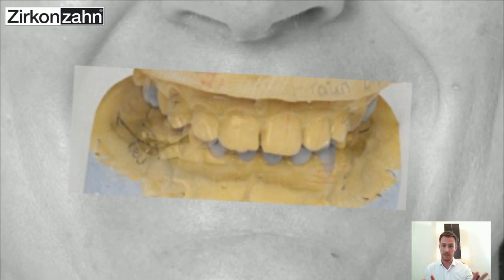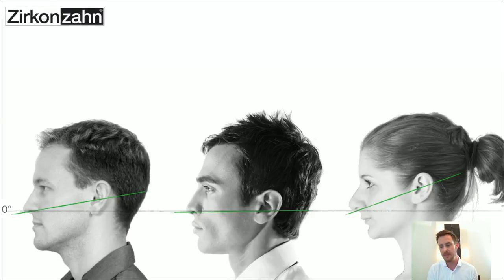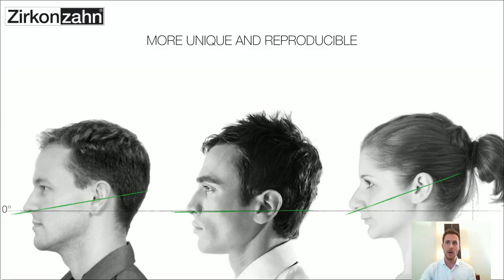But what happens in this kind of situation is that I send the crown back to the dentist, who wants to glue it into the patient's mouth, and then the crown is too long, because if we tilt it back, the crown would go longer, and the dentist has to adjust the length again. That's why we thought to make something new, a new system and workflow, to have a unique and reproducible workflow as well.